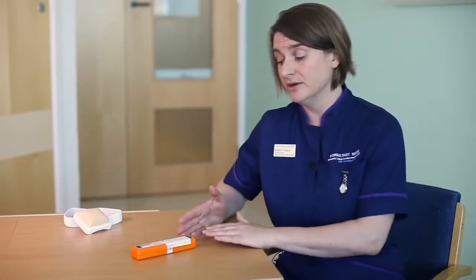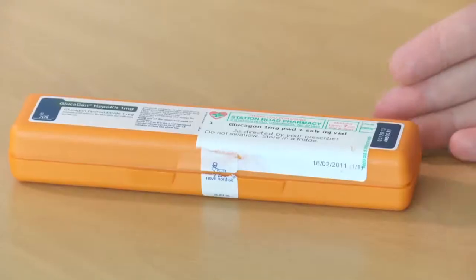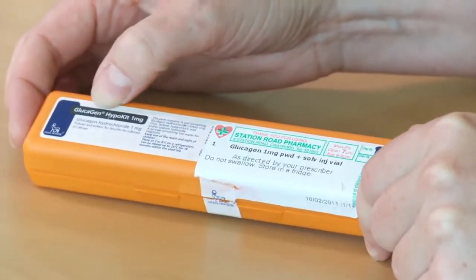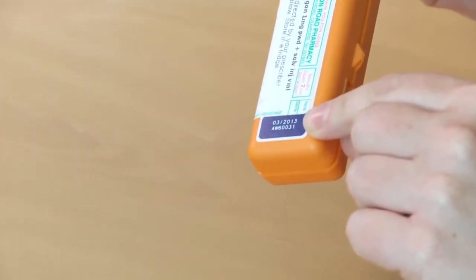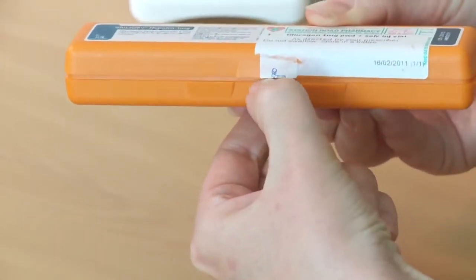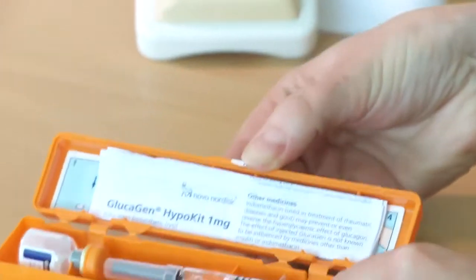So this is the glucagon injection box. You can get this from your hospital or repeat prescriptions from your GP. If you look at the box, it says GlucaGen HypoKit, and there's also an expiry date on the front. To open the box, you slit the seal on the side. This seal is broken because this is a training kit, and it opens the box.